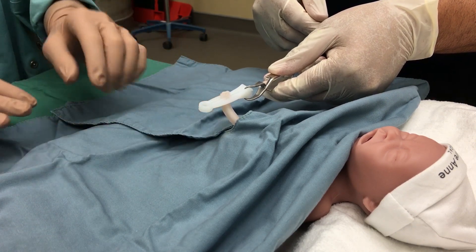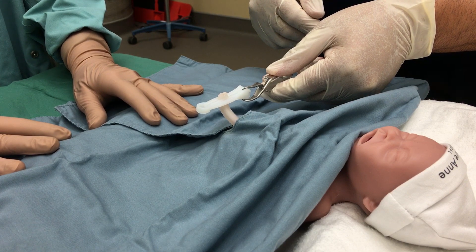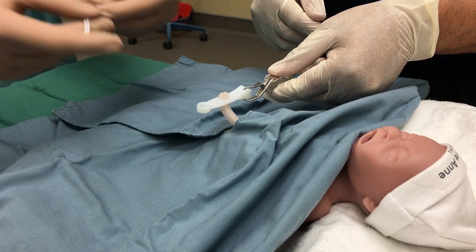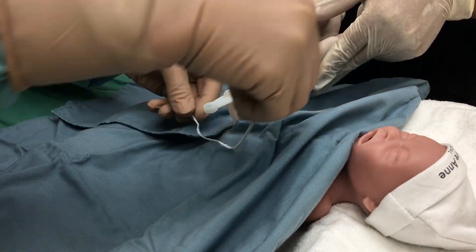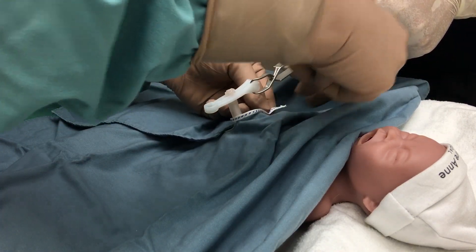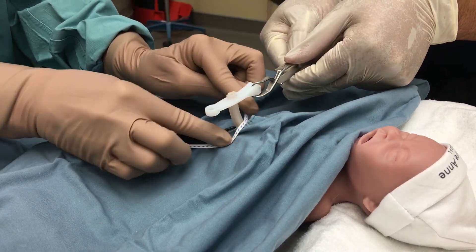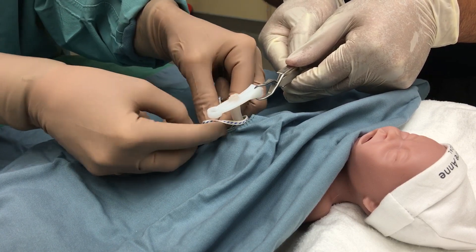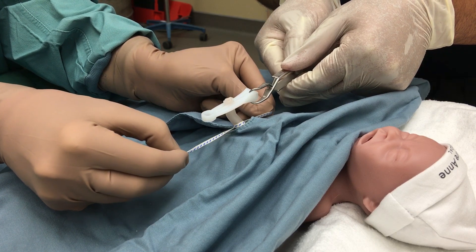We're now ready to start the catheter insertion. We have just finished cleaning the cord and stump, and we're now ready to cut the cord. First, we are going to carefully apply our tie, having an assistant hold the cord up vertically, and we're going to gently apply the cord tie. This will help minimize any bleeding after it's cut.